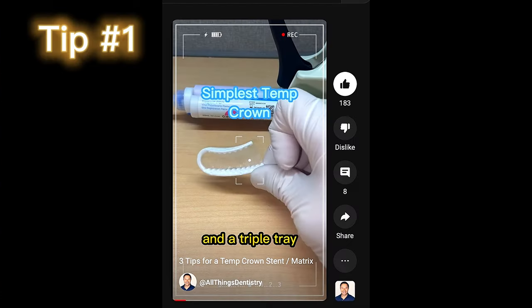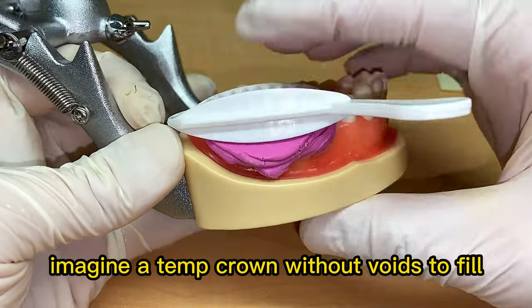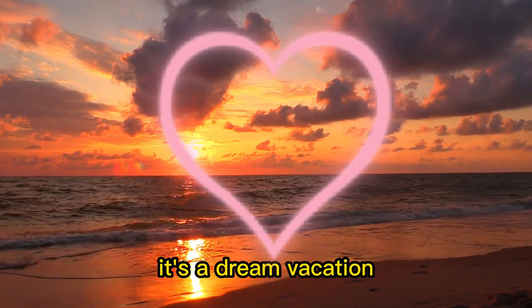Tip number one: check out my short about quick matrices and stents. Tip number two: fill from the bottom to eliminate voids. Imagine a temp crown without voids to fill — it's a dream vacation.